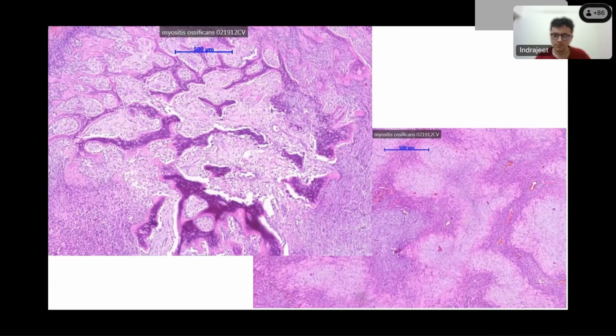Pradhan, are you there? Well, it looks like monomorphic spindle cells, and there is some bone actually. I don't know whether it is zonal calcification. No, that's fine. So Srilata, are you there? I'm just calling out the students who are supposed to answer questions.